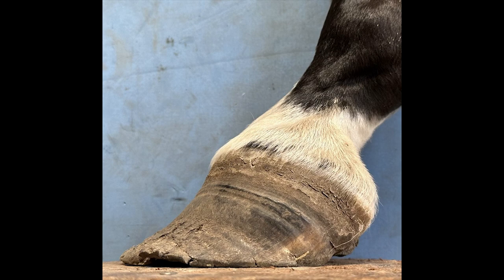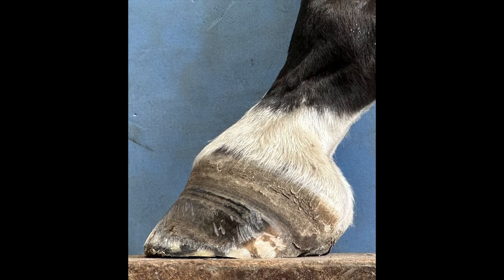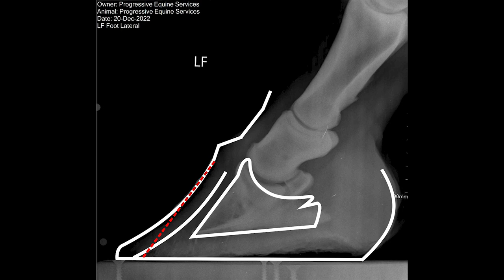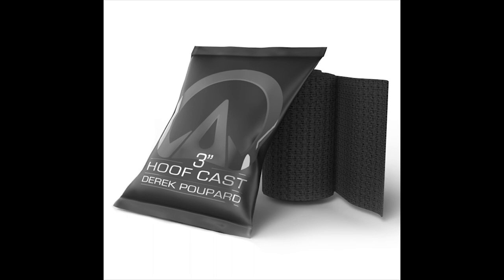As we have decided to remove the distorted hoof, it's important to replace some of the structural integrity that has been taken from the hoof capsule. The red line in the overlay highlights the amount of dorsal wall we have removed, so we will be using HoofCast as a way to both create some of this structural integrity, and it will also allow us to nail, but not nail into inflamed laminae and weakened hoof wall.